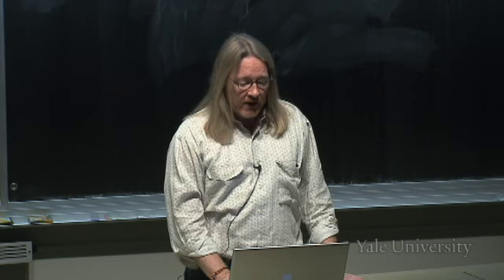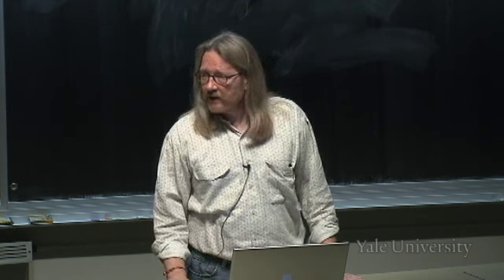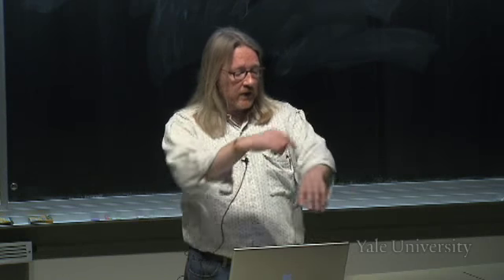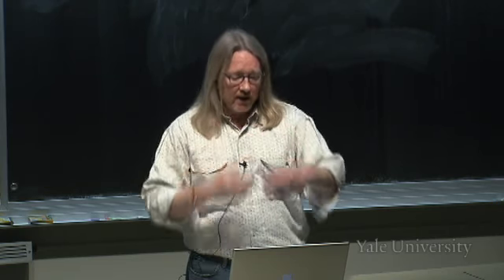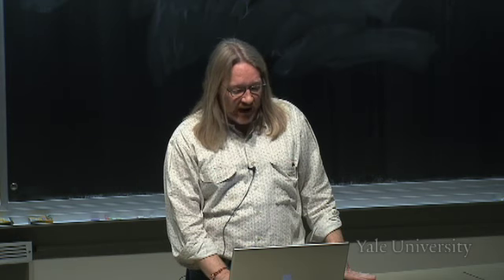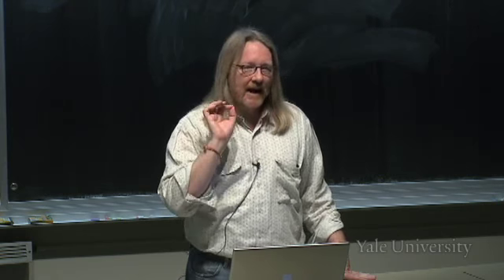You transmit sound into the skin and it moves forward until it hits an interface. And sound doesn't move so well across interfaces. So it moves through your skin and it goes down and it hits the bone. There's an interface between materials here that have two different properties: skin, muscle, bone. And on each one of those interfaces, some of the sound bounces back. And since the detector is both sending sound and receiving sound, it sends out a sound wave and then it gets the sound back. And it can determine how long it took for the sound to come back.